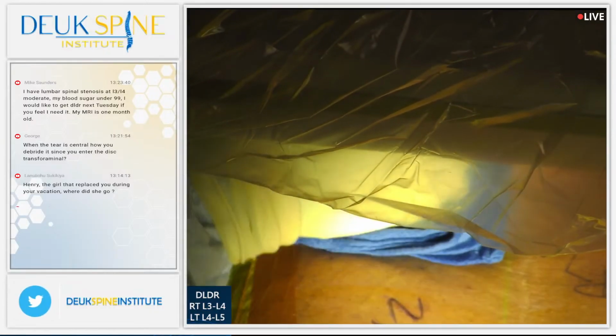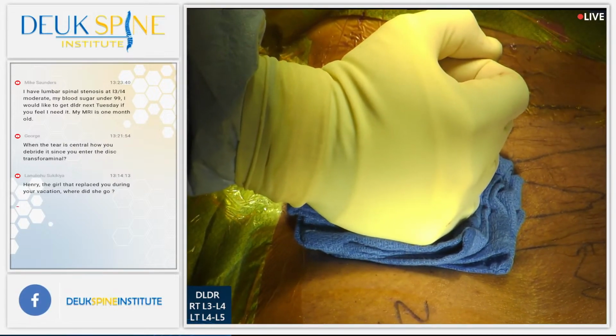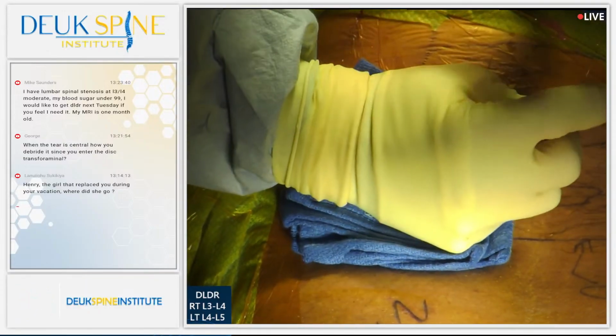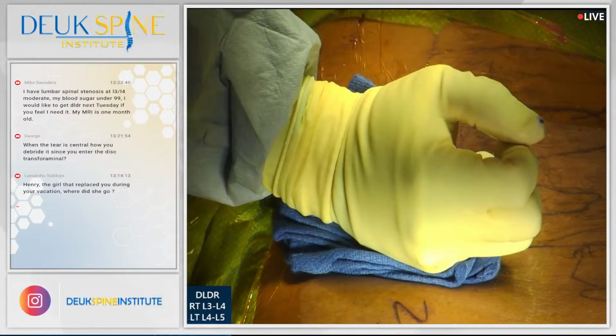All right, you have more questions? Yes, this next one is coming from George on YouTube, asking, when the tear is central, how do you debride it since you entered the disc transforaminal? George, that's a great question. Thanks for asking.